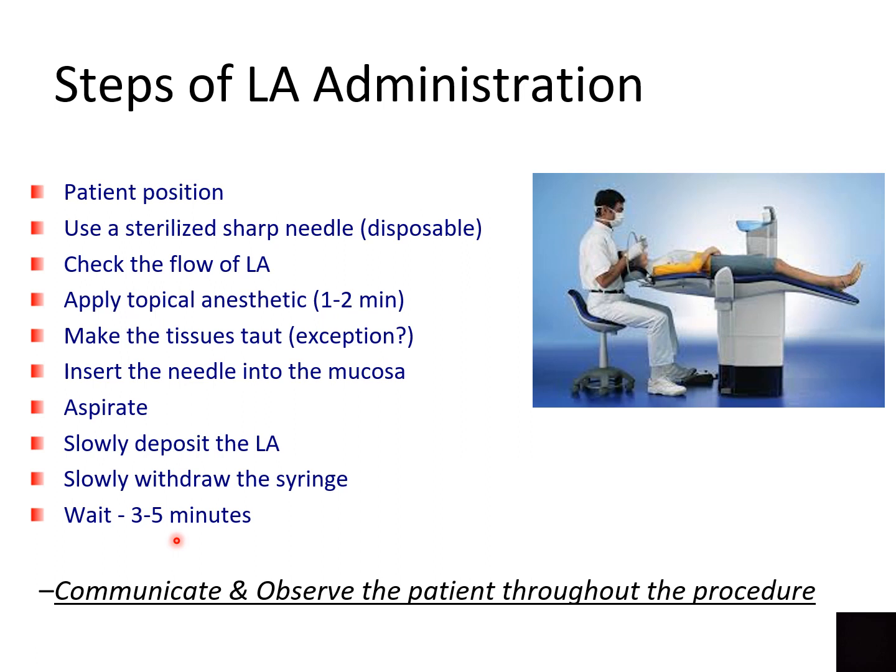Confirm it with the patient both by asking them if they feel numbness or tingling in that area, and also by using a blunt instrument, pinching the soft tissues just to ensure that the patients are pain free. Obviously, the pressure sensation would still be there, but they should not experience any pain.